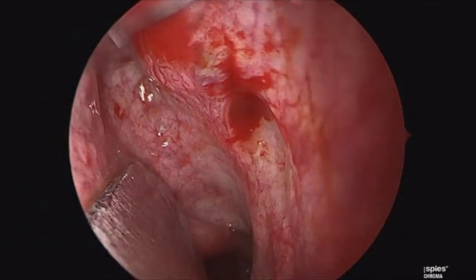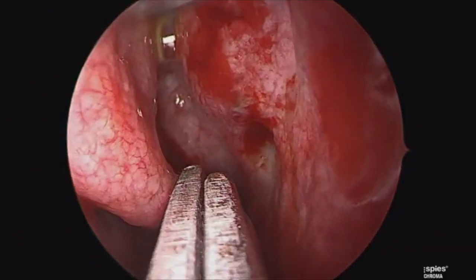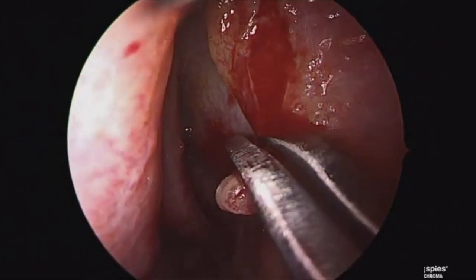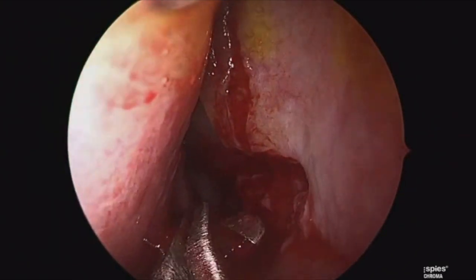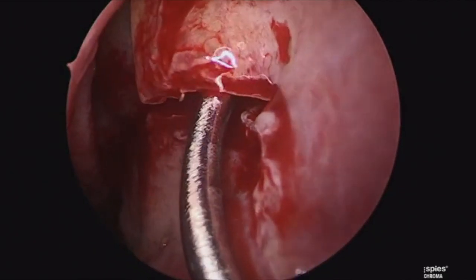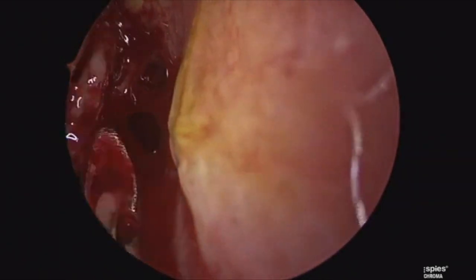Here we are in the left nasal cavity, gently medializing the middle turbinate and creating a relaxing incision in its basal lamella in order to medialize that well. This is a pediatric backbiter identifying the posterior aspect of the uncinate process, and creating a backbiter incision in the inferior aspect of that in order to help us identify the natural ostium of the maxillary sinus. This is being taken back towards the maxillary line, which is its attachment point. Here we are with the maxillary ball probe gently reflecting and lifting out that uncinate process with a 30-degree angled endoscope. We then use a 45-degree throughcutting instrument to remove the remaining portion of the uncinate process.